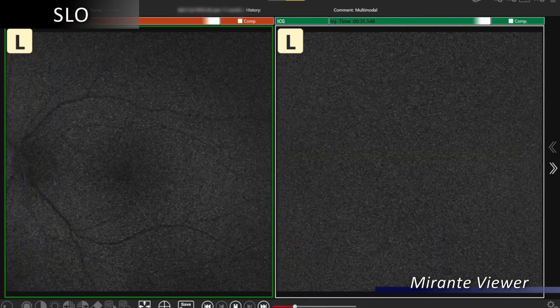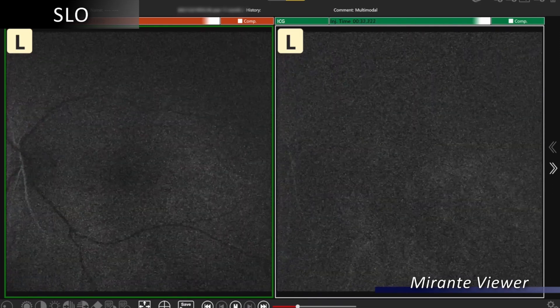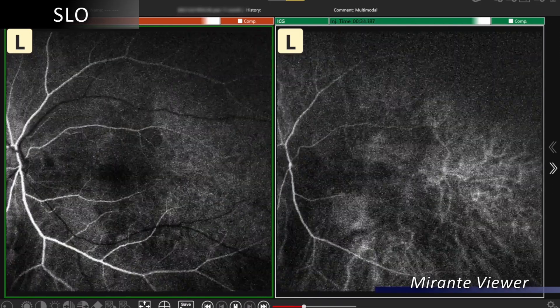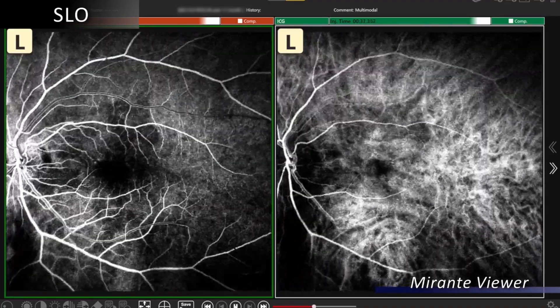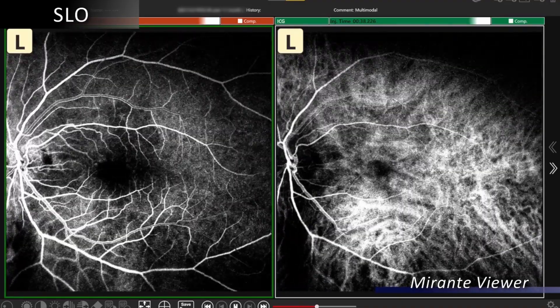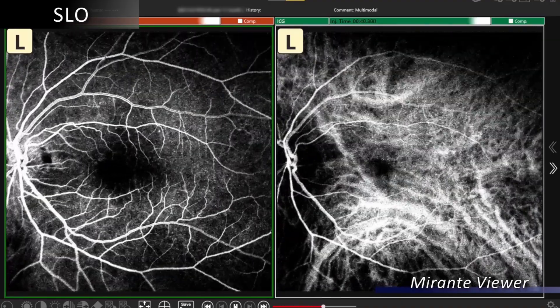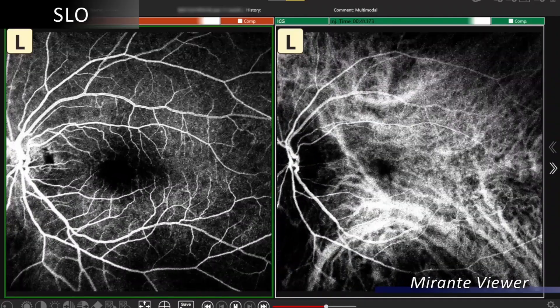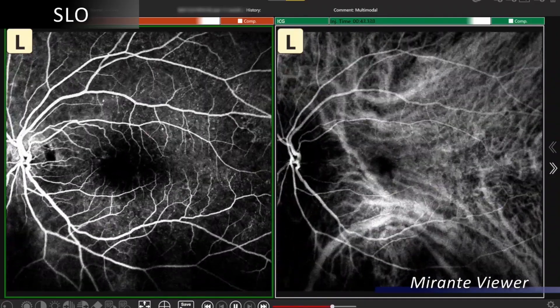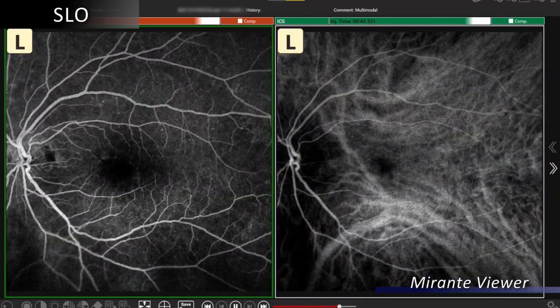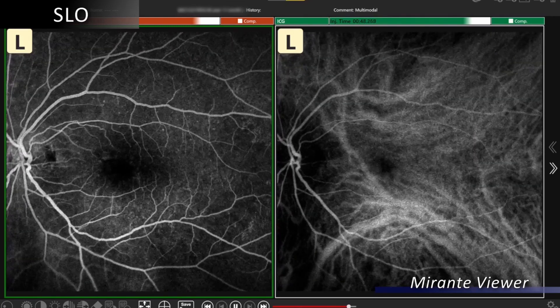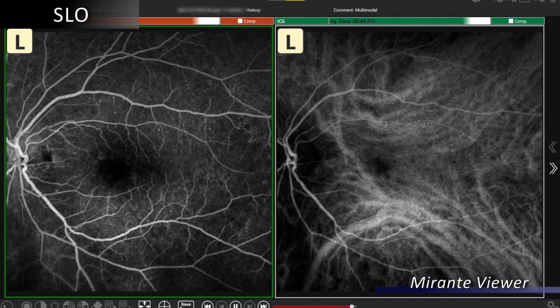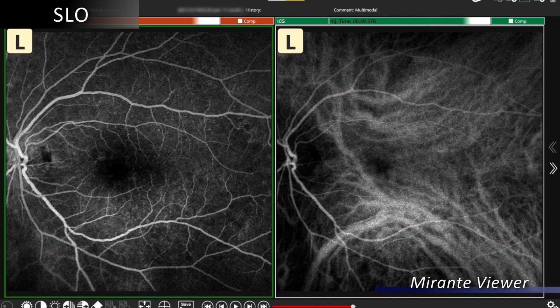With our dynamic fluorescein angiography and ICG imaging, we can synchronize retina and choroidal vascular analysis. Dynaamp can be recorded at a max resolution of 1024 by 1024 with 120 seconds of video. This will enable effective evaluation of blood flow.